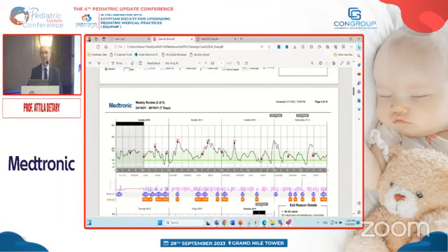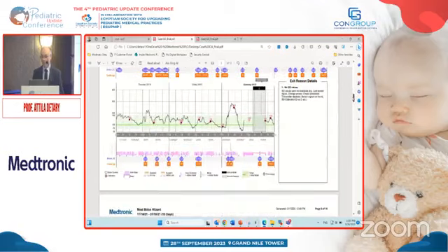And as soon as the system switches into the auto mode, then it is not a horizontal line anymore. It's this setting every 5 minutes. So it's kind of a pink band. And what you also saw, you saw these boxes, the brown ones, that's the carbohydrate information. And above the carbohydrate information, you see the blue bubbles. This is the insulin information. Okay, so that's an overall 2 weeks period.